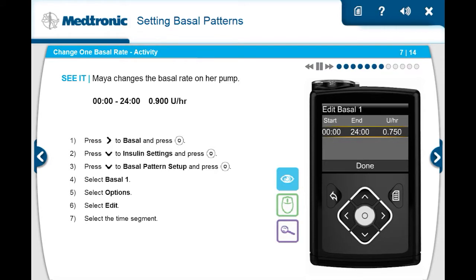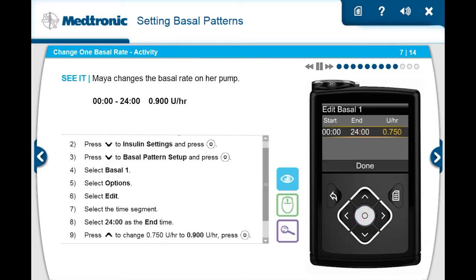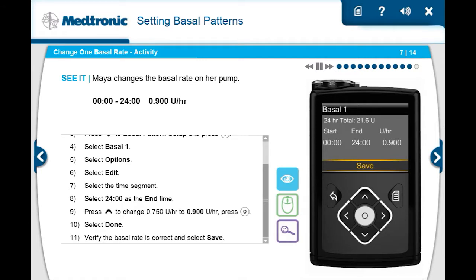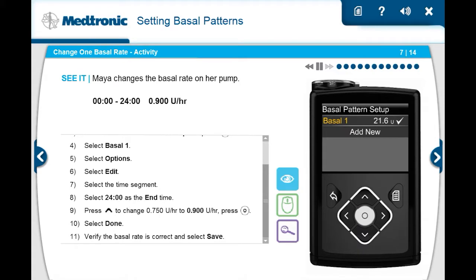She presses select on the time segment. Since the 12 a.m. time is already correct, she presses select once more. Maya presses up to change 0.750 to 0.900 units per hour and presses select. She selects done. She sees the 24-hour total has increased to 21.6 units. She verifies the basal rate is correct, then selects save. Maya has successfully changed her basal rate.